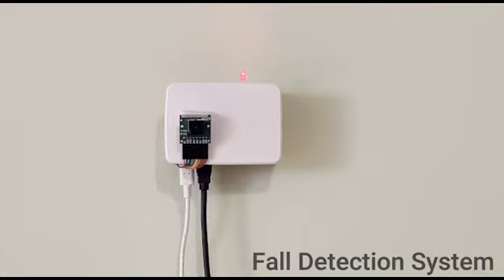The system is wall-mounted with a thermal camera connected to a Raspberry Pi. Here are the raw thermal images taken at the max frame rate, and you can see a person walking, and then sitting down. And when they get up, they then fall, and now they can't get up and call for help. So you can see that the person has fallen in the thermal images, but the question is, how do you get the computer to detect it?